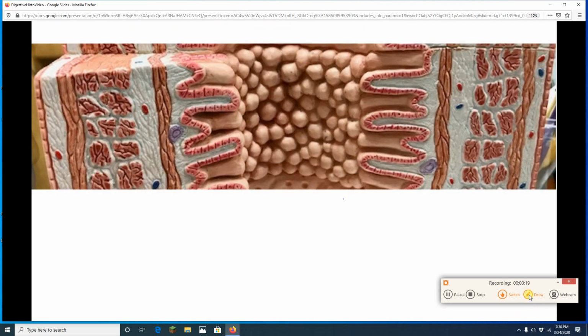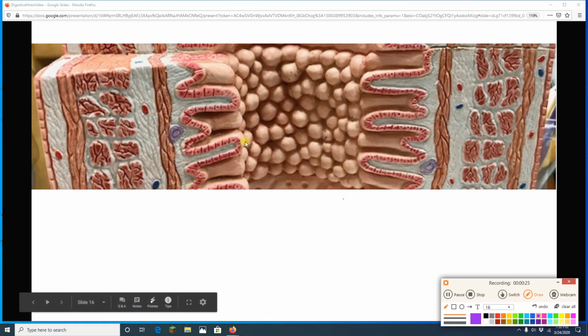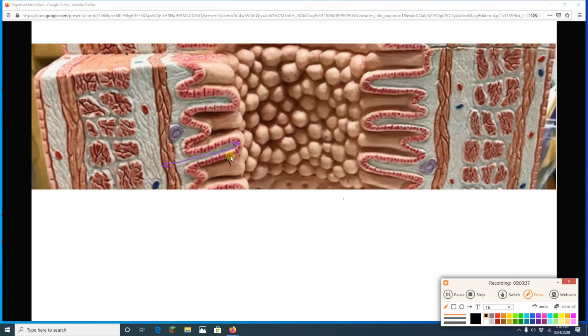We are going to do the small intestine. Let's start by reviewing our basic layers. Right here, my friends, we have the mucosa. The mucosa has its three basic sublayers. Right there, that is the epithelium. It is simple and columnar. This grayish region here is the lamina propria. And this little skinny stretch of smooth muscle is the muscularis mucosae. So that is our mucosa.